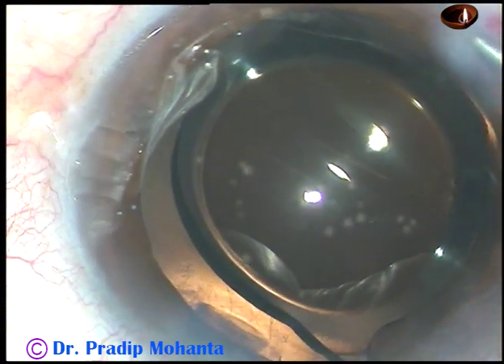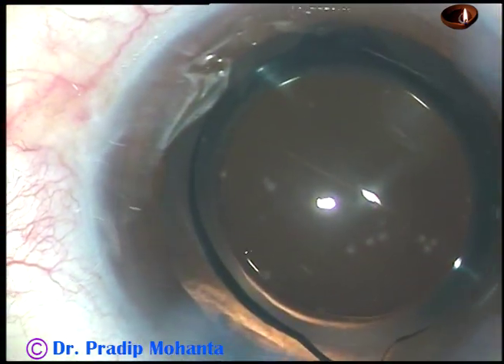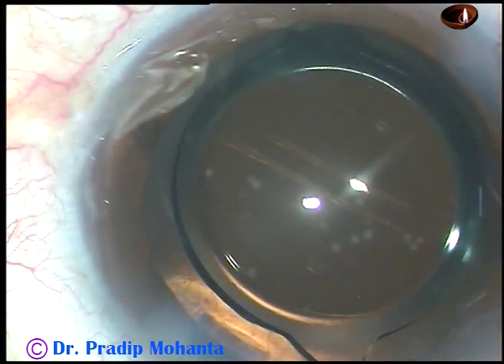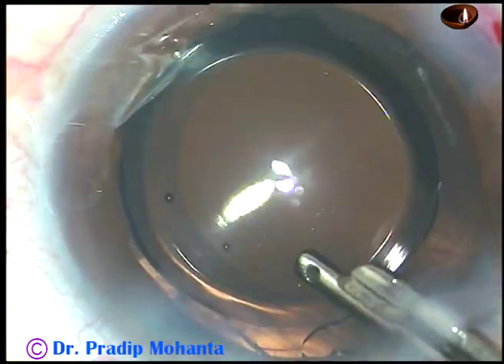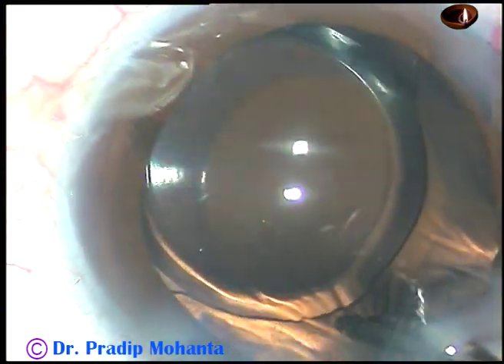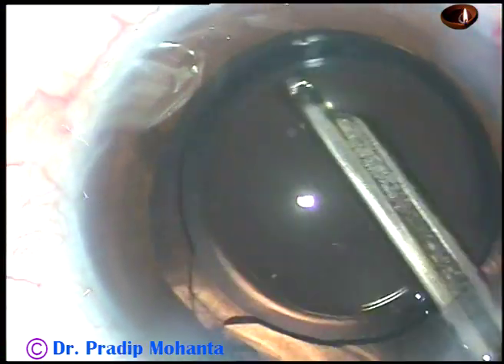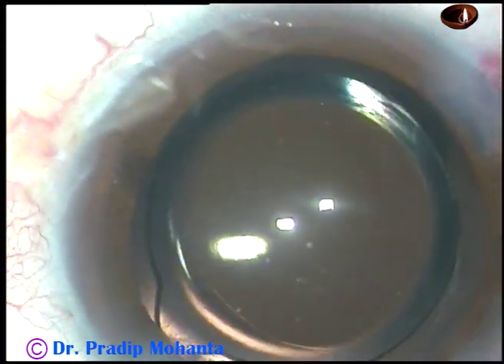The side ports are closed by corneal stromal hydration. Corneal stroma on either side of the side port is hydrated and the side ports close. This is the final lavage of the anterior chamber. Some visco was there in the lumen of the cartridge, it is coming out during this final lavage. The lens has also been dialed a bit and the haptics are about 90 degrees away from the main incision. The anterior chamber is nicely formed.